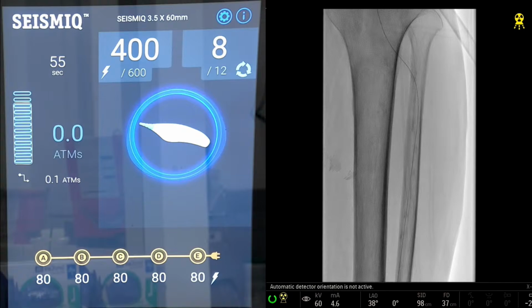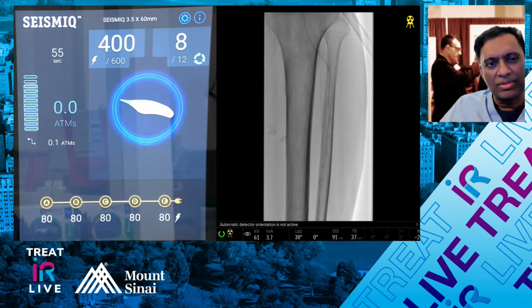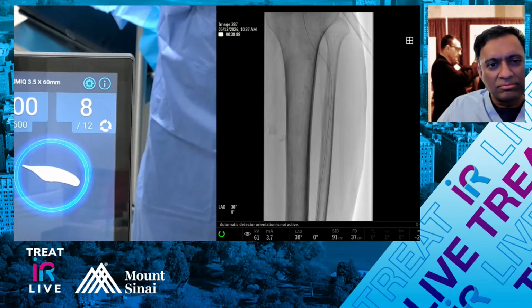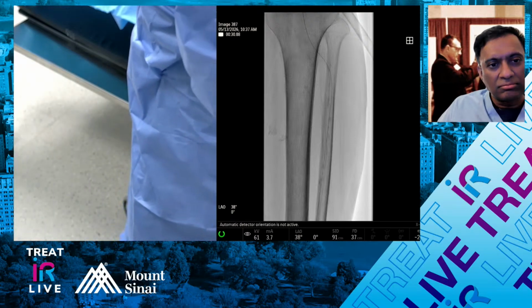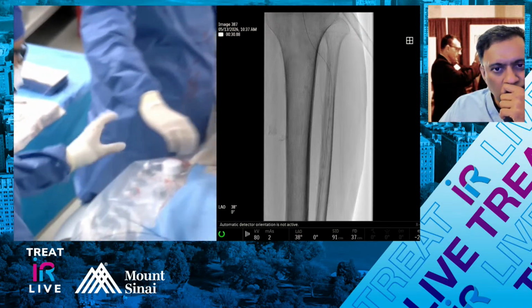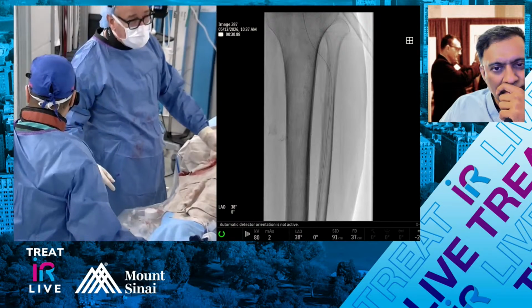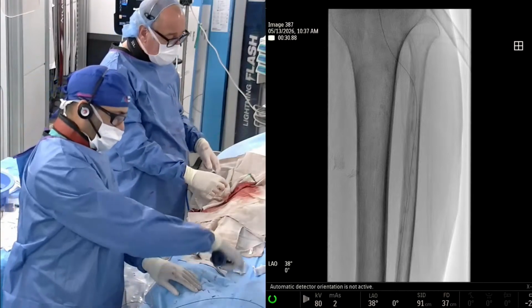And so when you only have 1 or 2 emitters on, does it generate more power at that site? No, it's the same amount of power. But again, if you think about it conceptually, if you want to get 600 charges out of this and you have a focal, 1 centimeter long eccentric thing, you might want to use one emitter directionally for 120 charges, and then switch to a different emitter and reorient it, and use another 120 charges, et cetera, et cetera, et cetera.